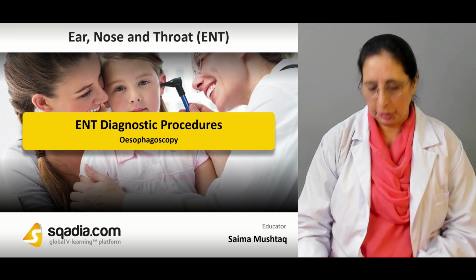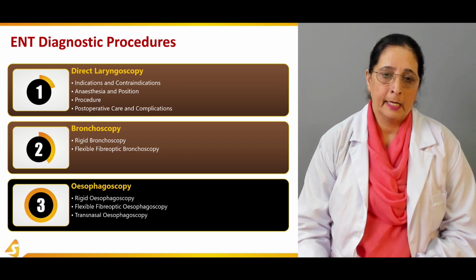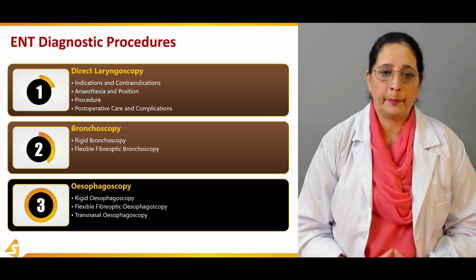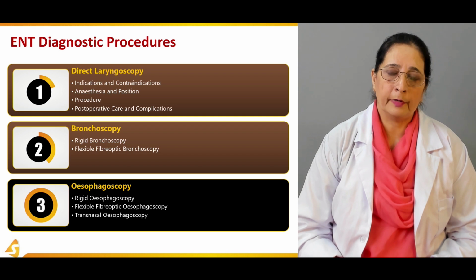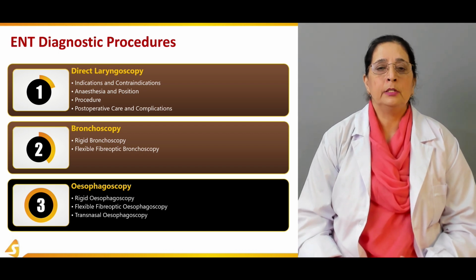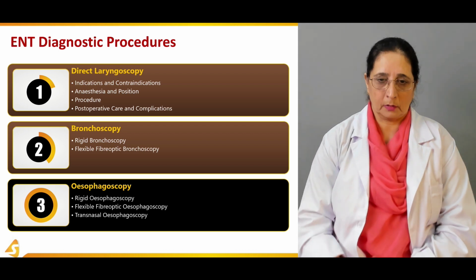Three types we have, like bronchoscopy: rigid esophagoscopy, flexible fiber optic esophagoscopy, and transnasal esophagoscopy, through the nasal cavity.